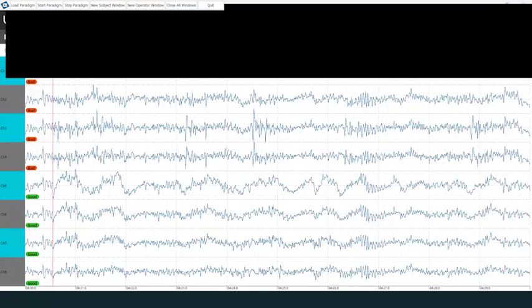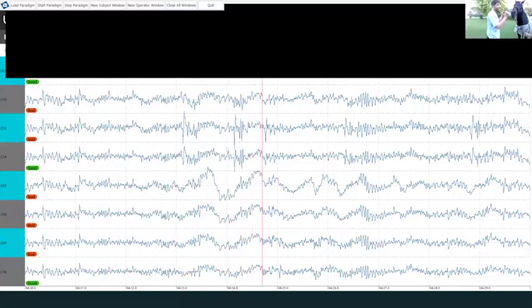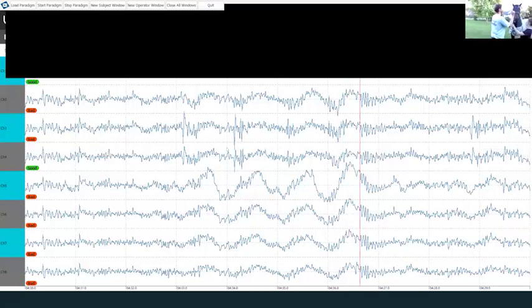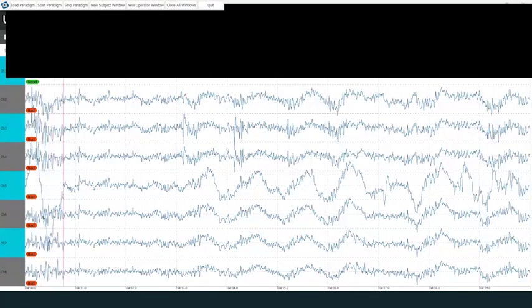Nice alpha. Did you see it at second 426? Beautiful alpha burst. I can try again. Let's try it. It just occurs when he's relaxed.